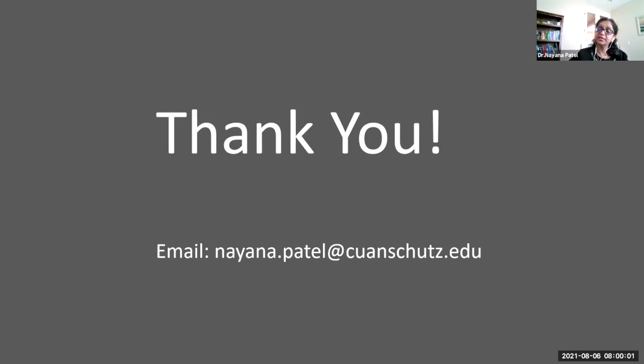Another rationale for not favoring in-bore biopsy is that we know multiparametric MRI can miss clinically significant prostate cancer. So simply doing only MR in-bore biopsy may not be adequate in terms of the diagnosis and to triage the appropriate treatment. So we actually do MR guided MR ultrasound fusion biopsy along with the systematic core biopsy for the complete evaluation of the gland for diagnosis purposes.